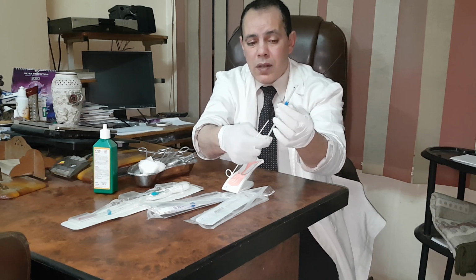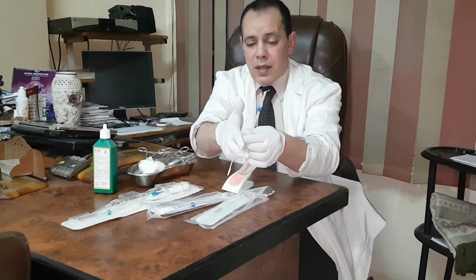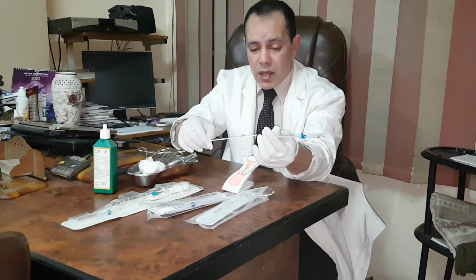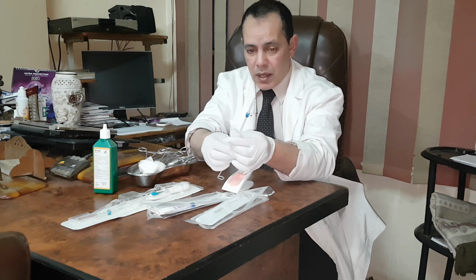This is called the plunger. This is the plunger. And this is the flange. This is the flange. And this is the plunger. We insert the plunger inside the sheath or insertion tube like that. Okay?